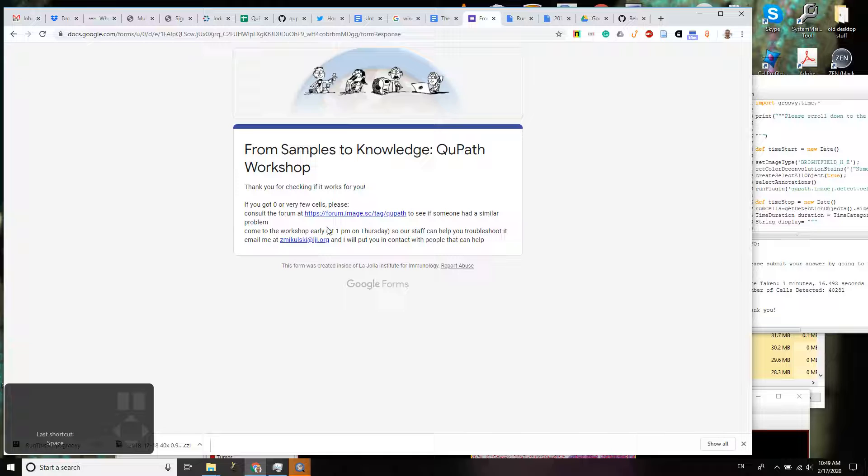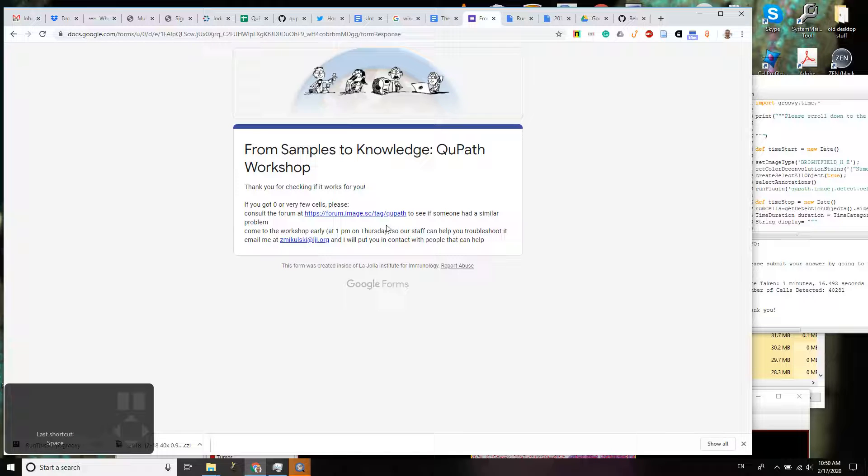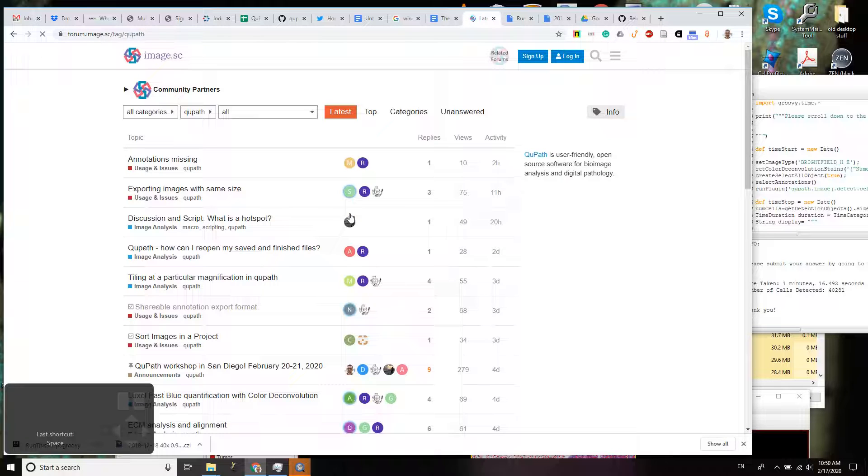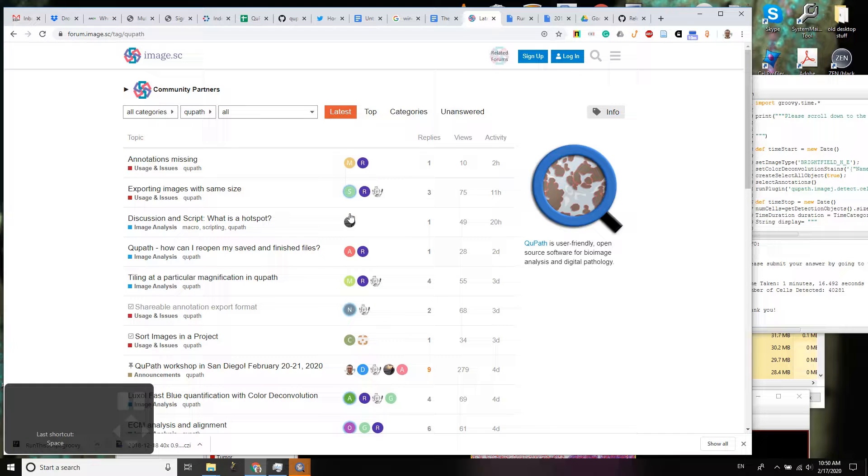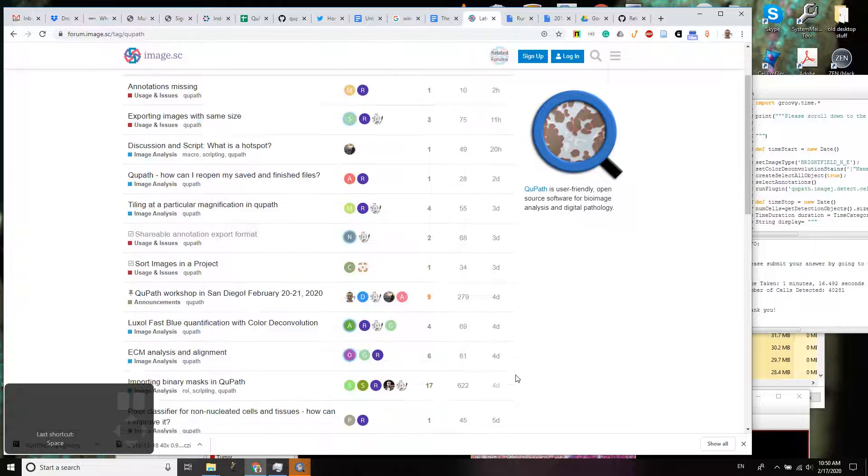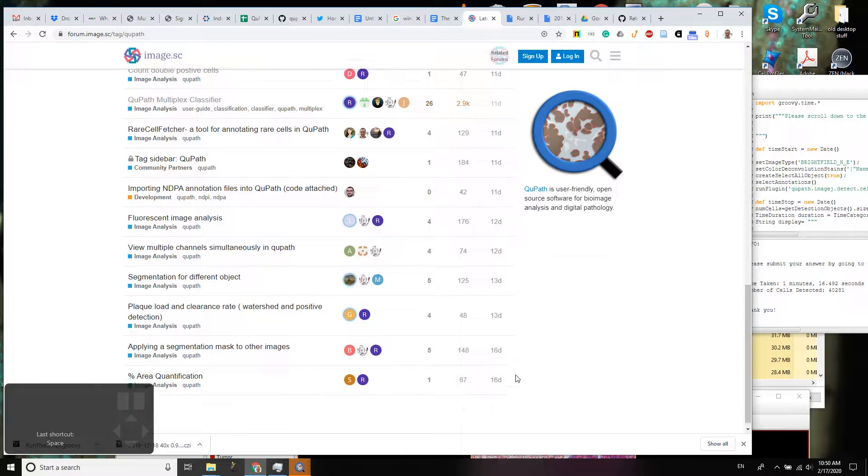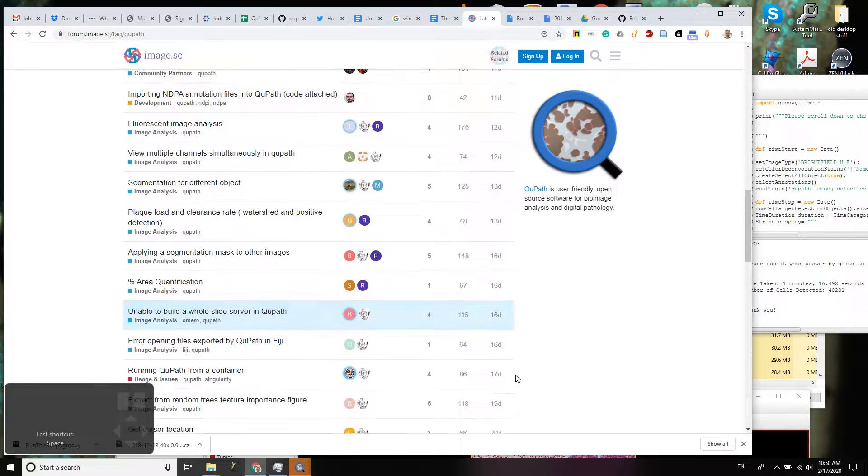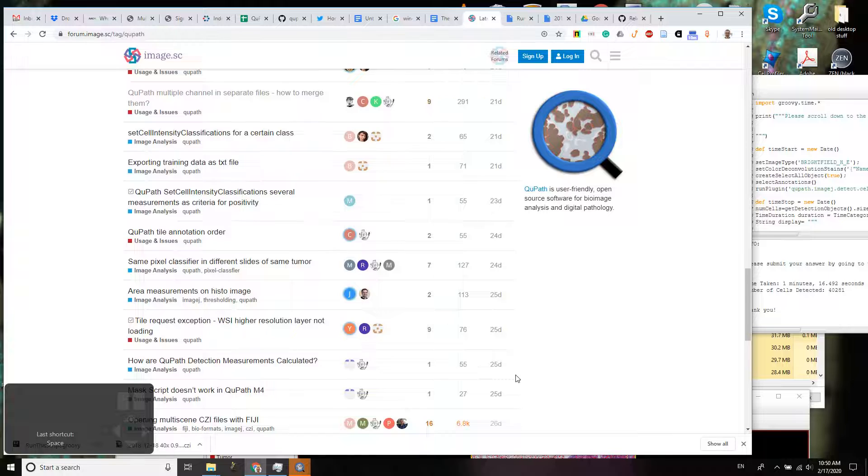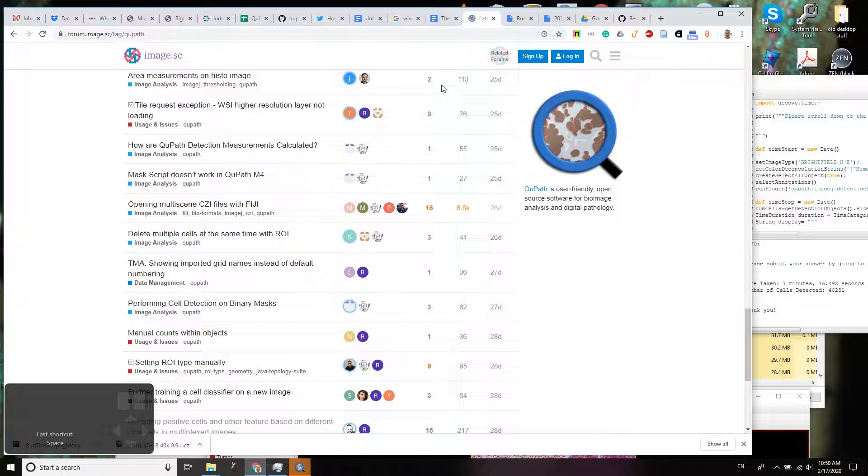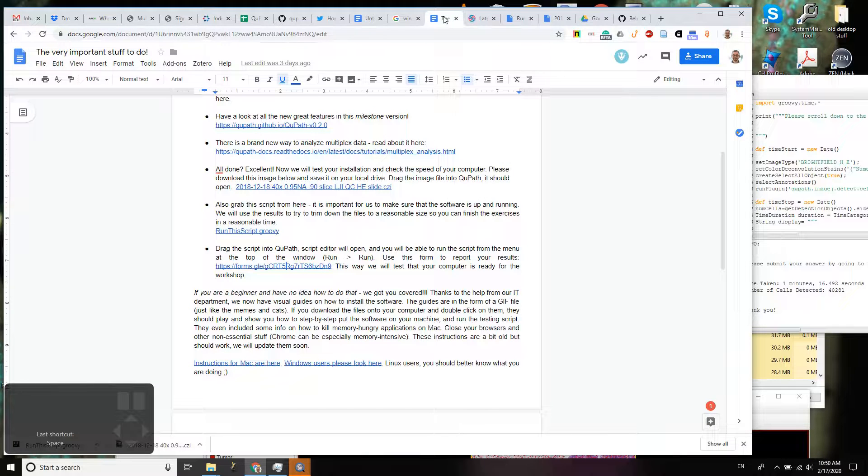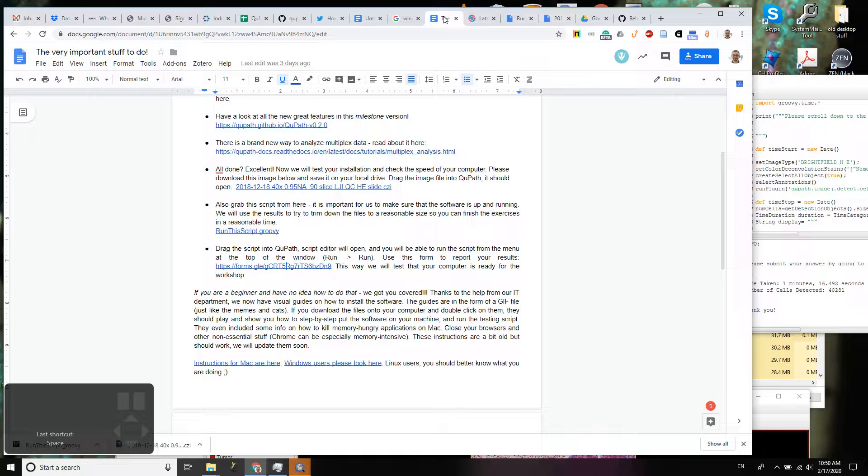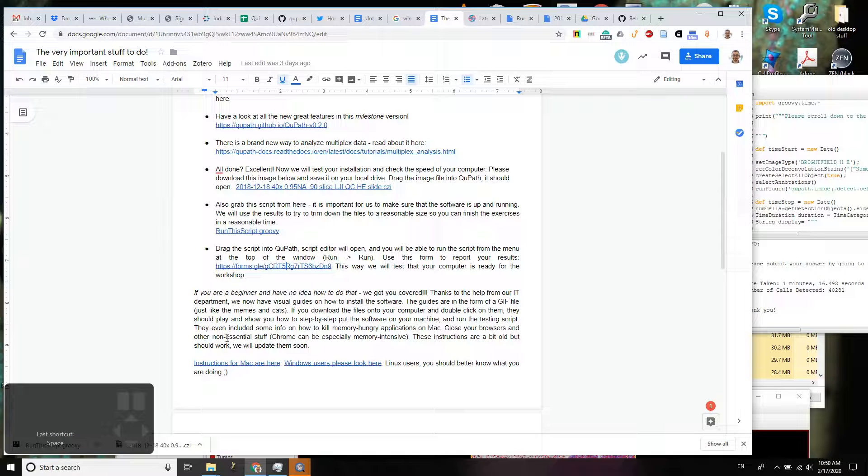If you got zero or very few cells or something didn't work, go ahead and check if the problem that you had was not already figured out by someone on the QuPath forum. I'm going to open this link. It's a very, very, very friendly community that collectively solved a lot of problems so far and we're still struggling to achieve world peace but we're working on it.